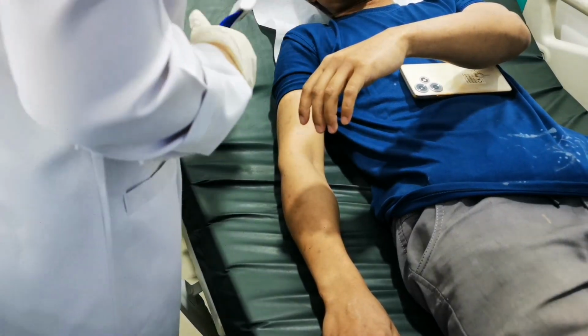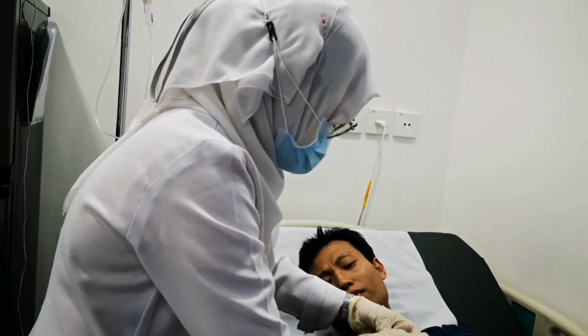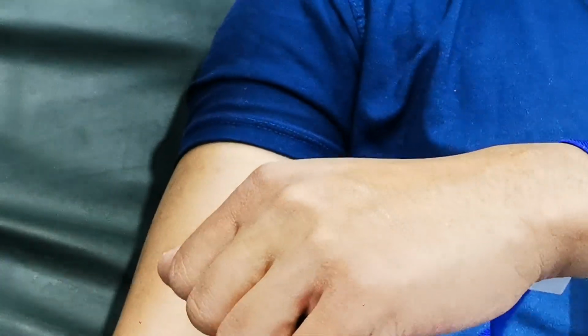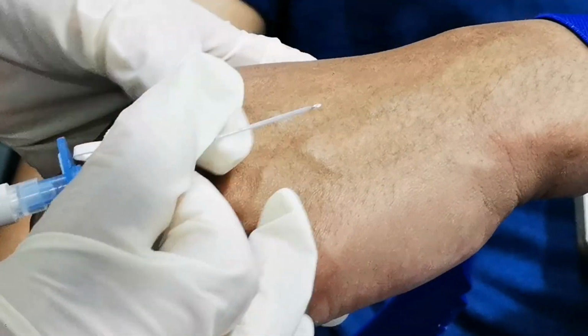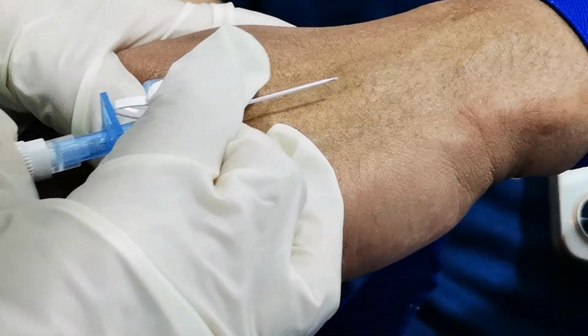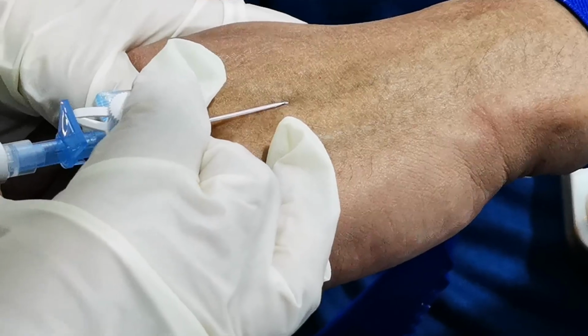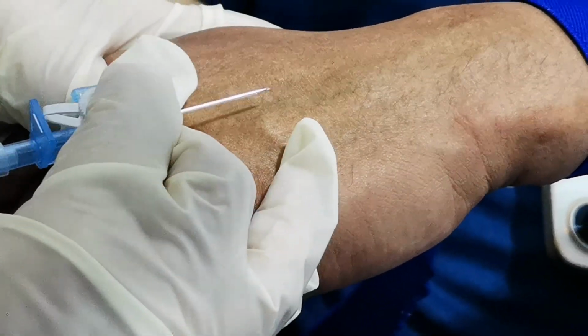After selecting the site, apply the tourniquet. Then disinfect the site with an alcohol swab. This is to prevent infection. Using the non-dominant hand, hold the skin taut about 1 to 2 inches below the venipuncture site and anchor the vein. Align the IV catheter with the vein, with the beveled side up.